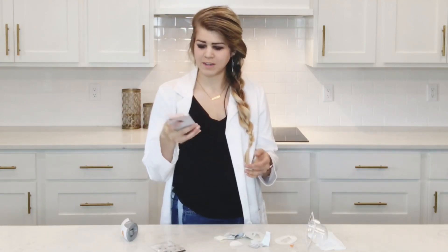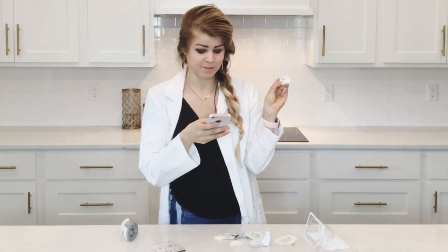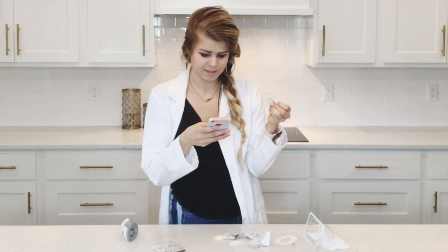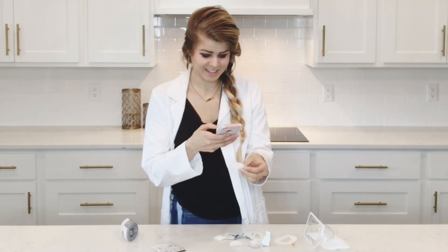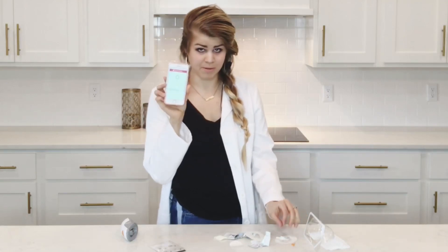I'll just start my new sensor on my phone. Apply your code — the one you're going to save because we're going to do that restart in 10 days. Let's take a photo of the code. It's looking good. Start sensor. Two-hour warm-up — here we go.